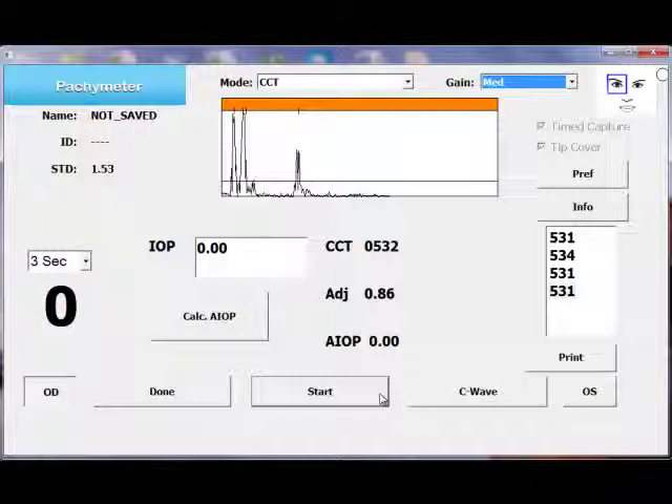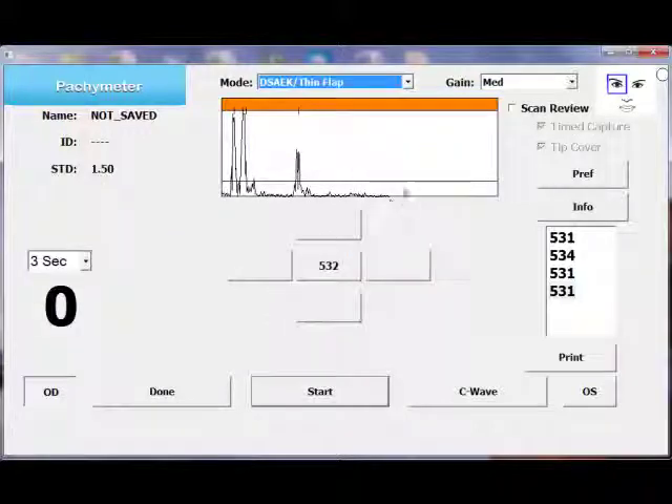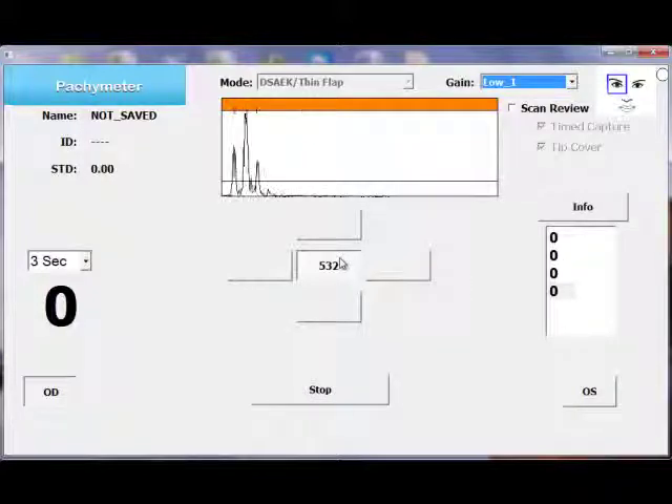Now that I've shown you how to do a central corneal thickness measurement, I want to show you how to do thin flap measurements for creating DSEC. You first select the mode as DSEC thin flap mode and make sure that the cover and the time capture options are selected. Most of the time you have to bring down the gain a little bit — right now I'm using plastic, but on the cornea you may not have to bring down the gain as much.